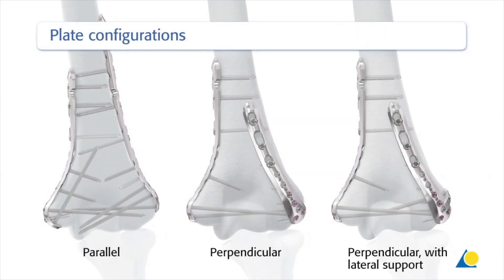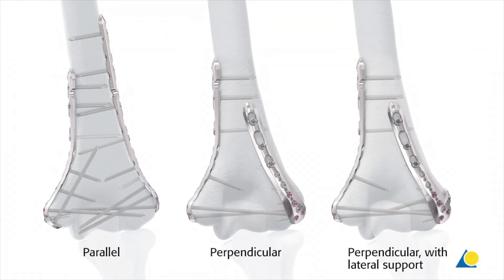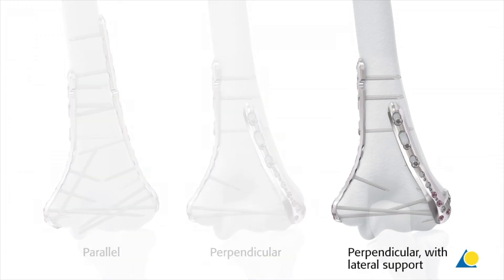The VA-LCP elbow plating system offers three main double plating configurations for the distal humerus. In this presentation, perpendicular plating with lateral support will be shown. The dorsolateral plate with lateral support is used with the medial plate. The screws of the lateral support target the articular block.